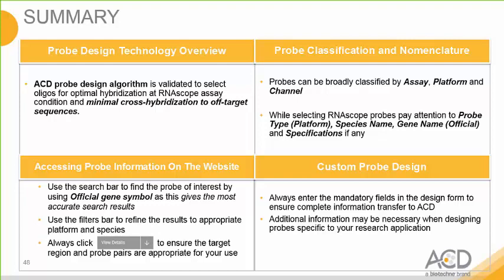We got another question. Can we design probes for introns? The answer is yes, and we have experience designing probes targeting introns, and mostly people use those intronic probes for detecting transcription activation or nascent RNA. You can fill in the form if you are interested in designing probes for introns.